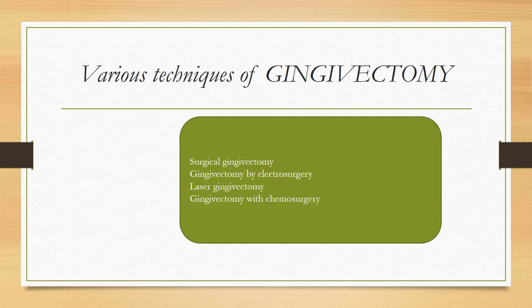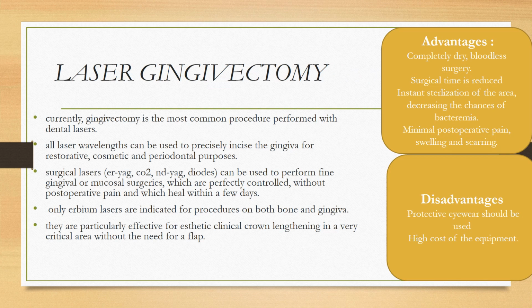So there are various other techniques of gingivectomy. As we said before, this procedure can be done by scalpel, electrocautery, laser, or chemosurgery. Out of those, the most important one is the laser gingivectomy that we are following here. Currently, gingivectomy is the most common procedure performed with lasers.